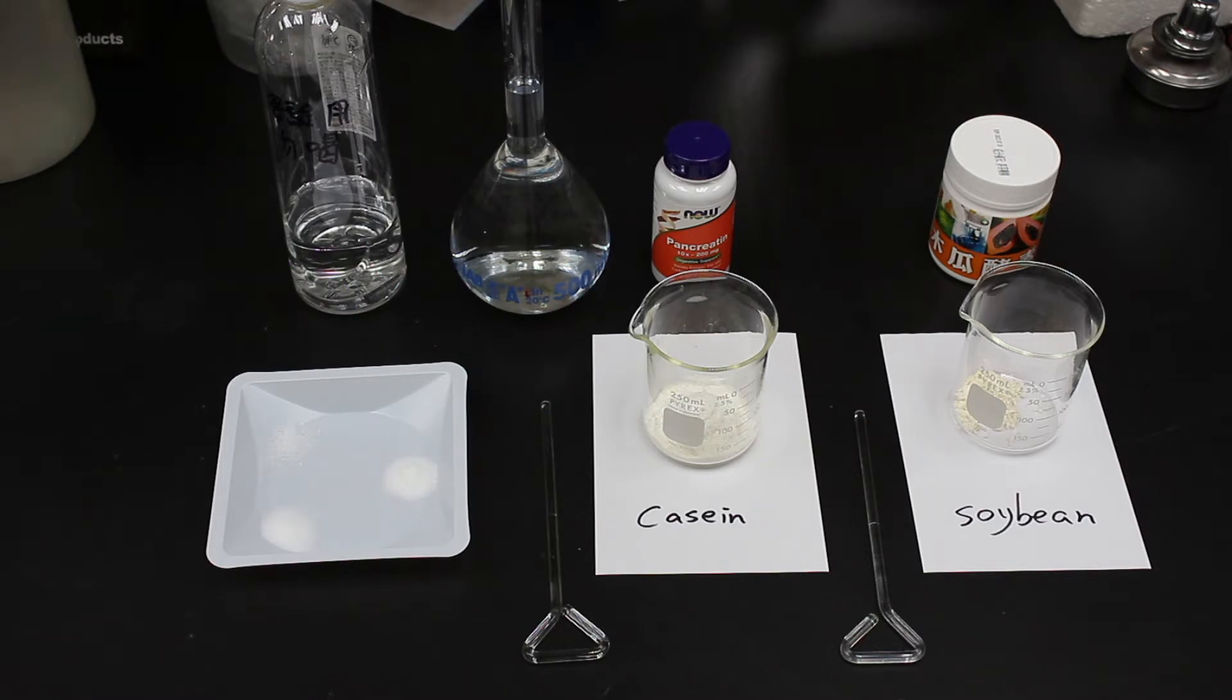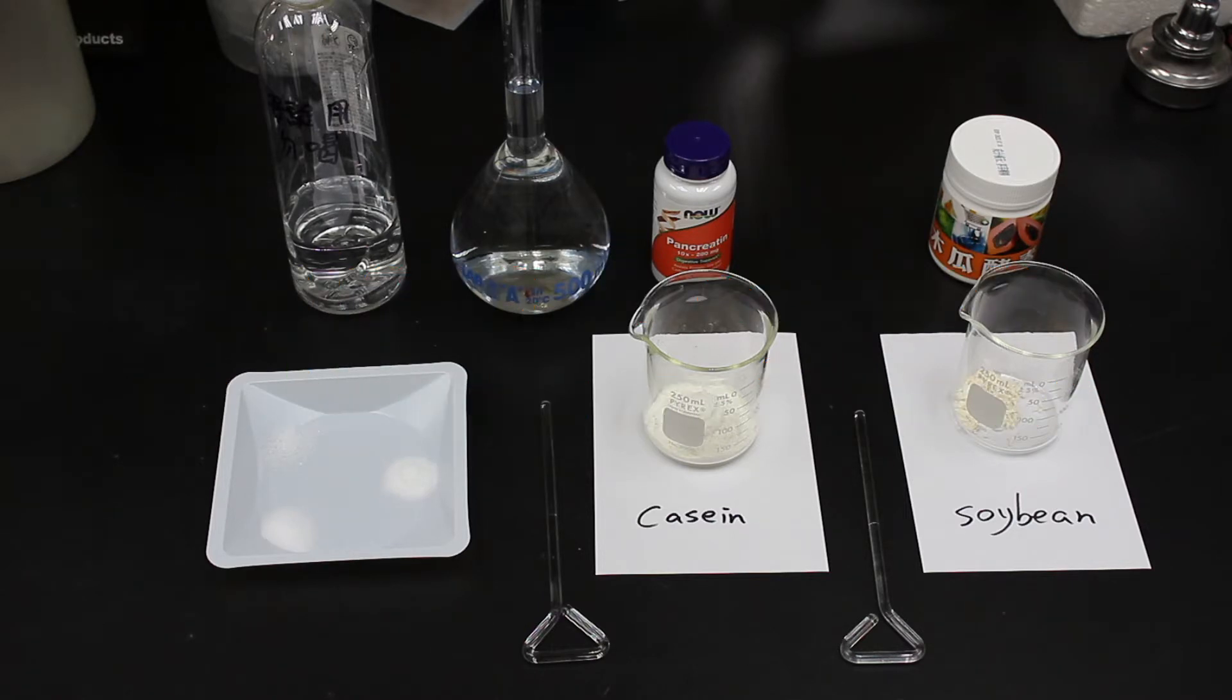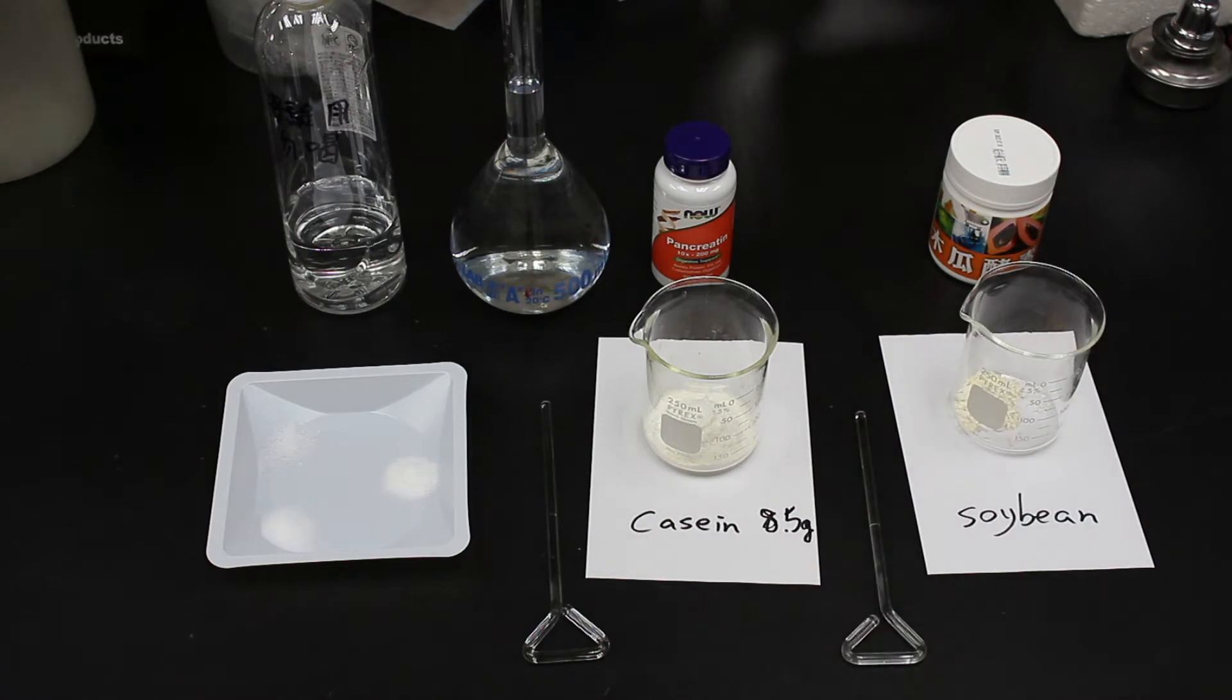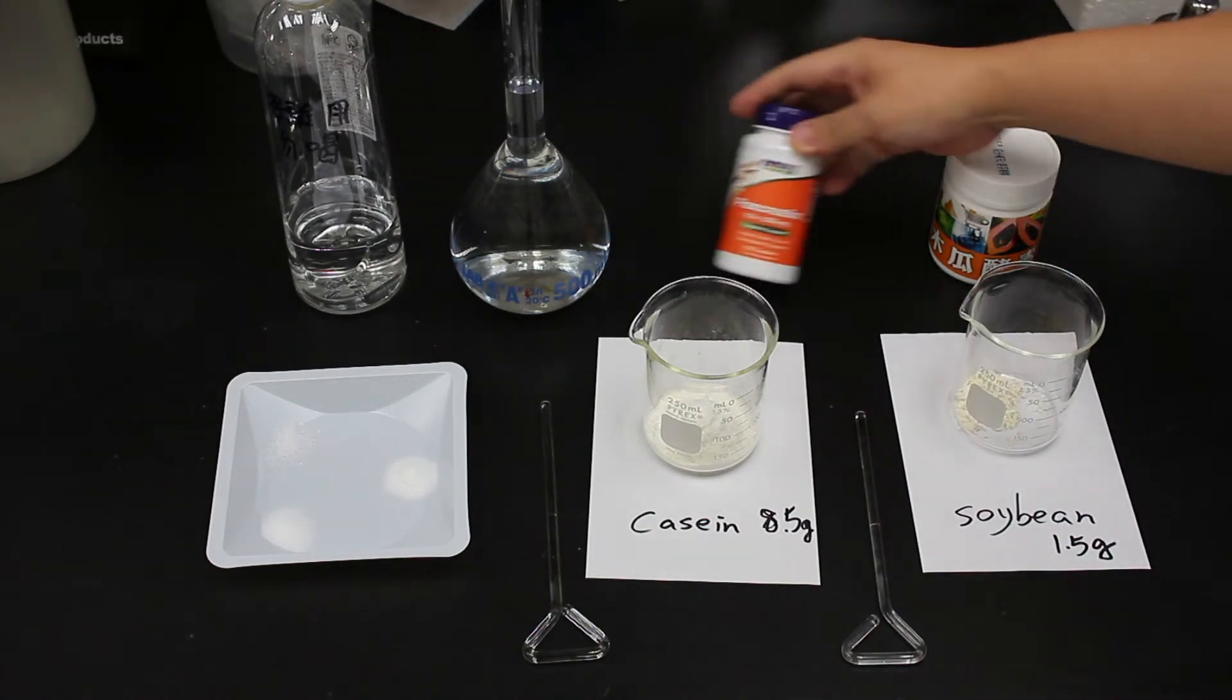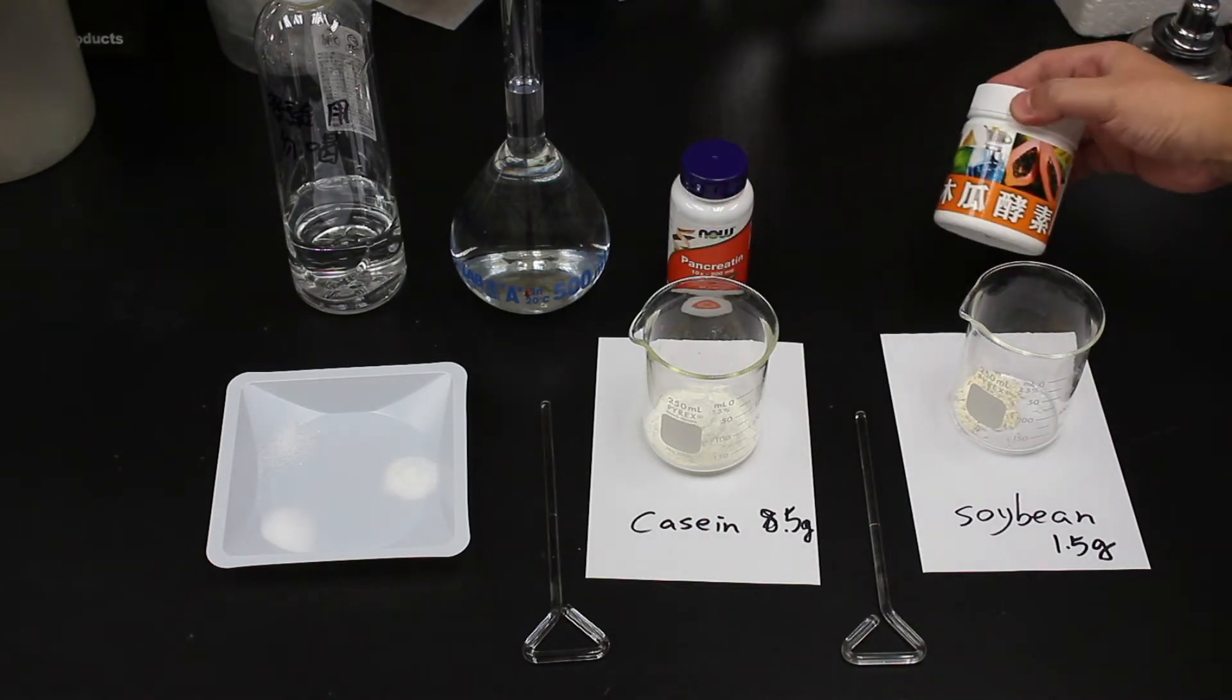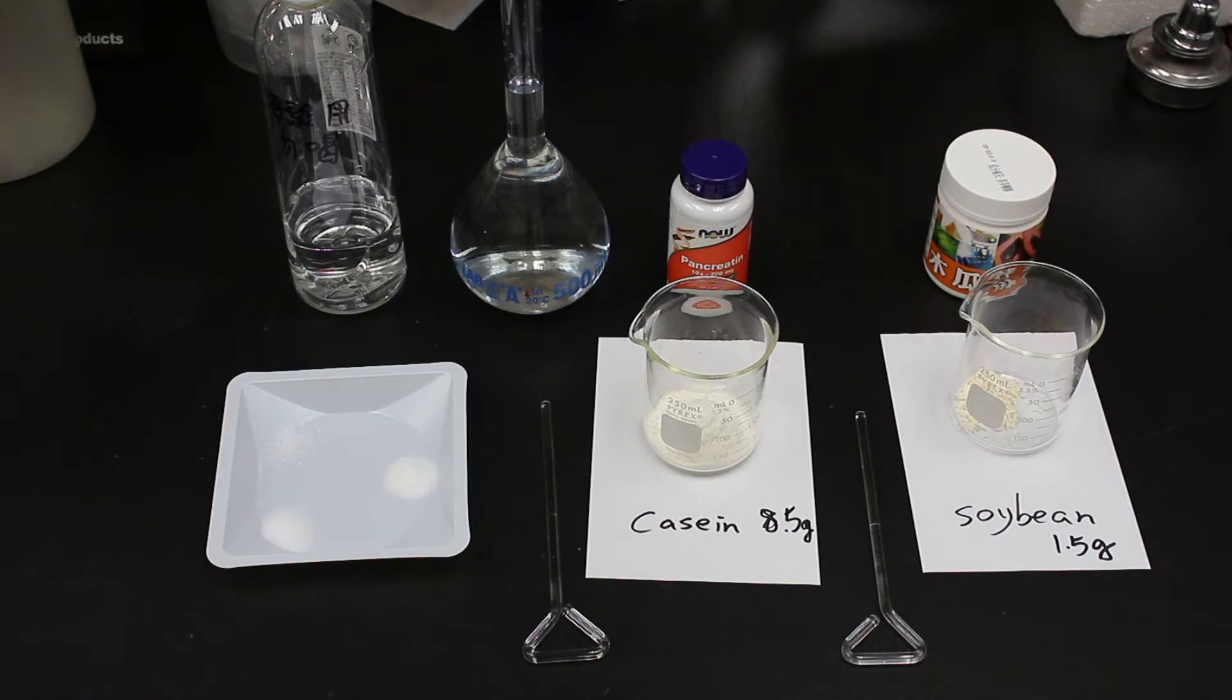This growth medium consists of tryptone and soytone as nitrogen sources, so I will make these two ingredients first. Here I have 8.5g of casein and 1.5g of soybean protein, which I will digest using pancreatin 10X and papaya enzyme into tryptone and soytone.